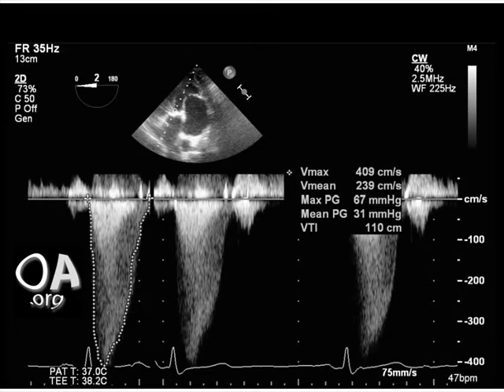This is the computerized velocity profile tracing of the same waveform. There is much information obtained once the blood flow velocity profile is traced. The maximal velocity traced is 409 centimeters per second. The maximum pressure gradient is 67 millimeters of mercury, and the mean pressure gradient is 31 millimeters of mercury.